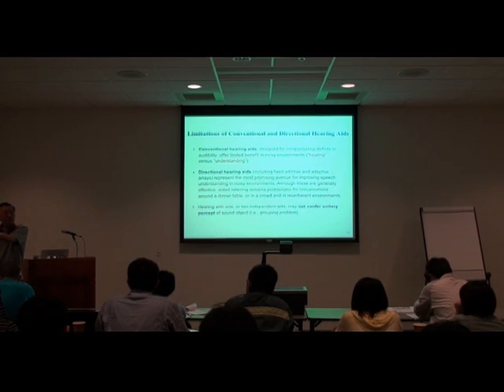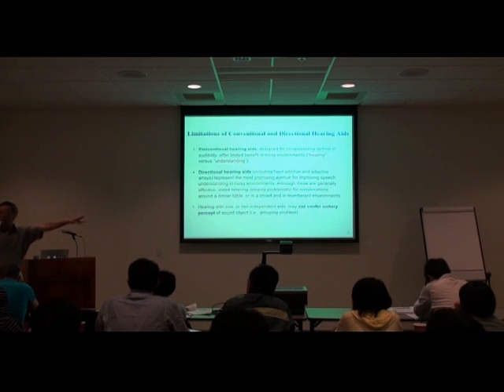So when the device or the ears are not getting the expected input to perform this grouping and stream segregation, you are in trouble. Because then the sound becomes non-coherent, since sound streams from different streams cannot converge to form what we call coherent perception of sound.